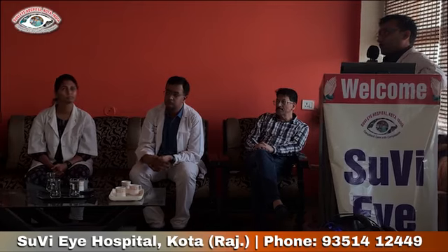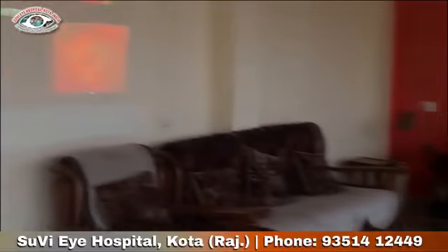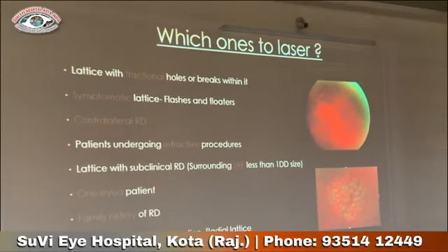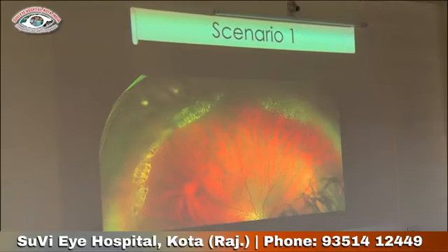So if there is no traction at all, we can apply laser in these conditions. For patients who play contact sports, we can also laser. So this is a scenario.